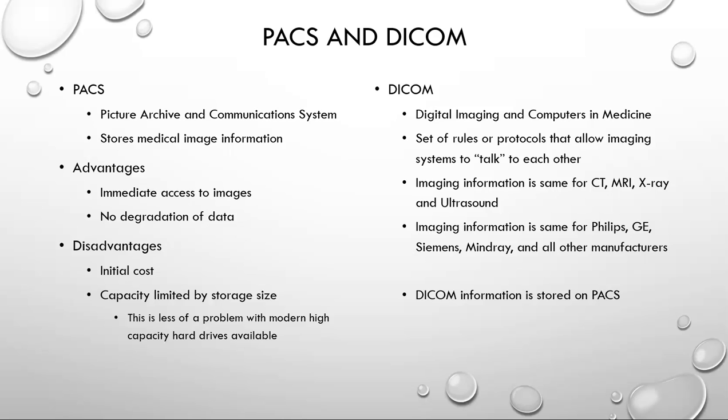PACS and DICOM. These are two more systems, but they are not necessarily part of our ultrasound image. These are systems that attach to the ultrasound machine. PACS stands for Picture Archive and Communication System, and this is where we store medical information today. This has the advantages of immediate access to the images by not only the radiologist, but by anyone that wants to look at them and has access. And it also results in no degradation of data. PACS information is stored with no loss of information.